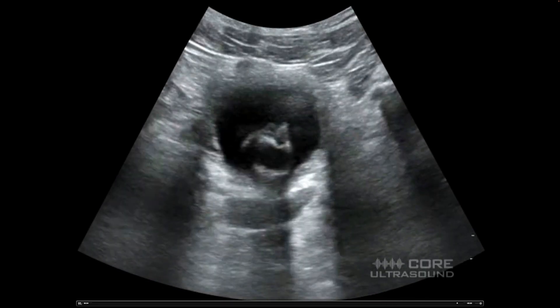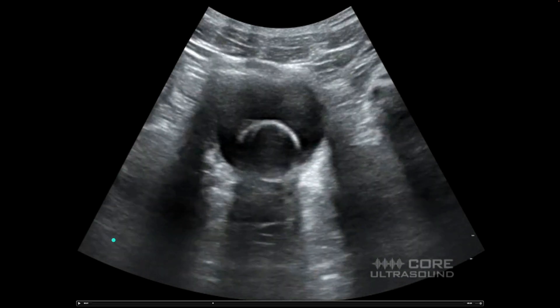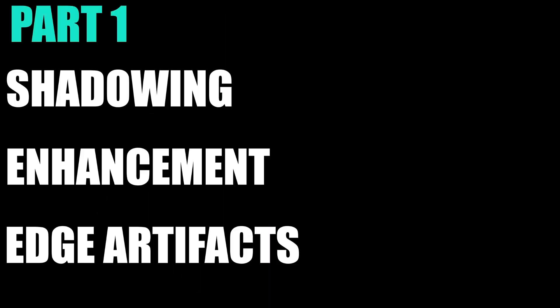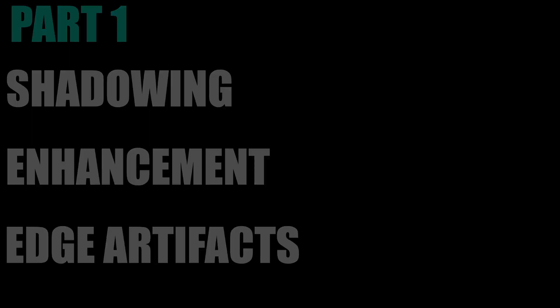In this clip we actually see all three artifacts. This is a bladder in the transverse orientation with a Foley bulb in it. We're seeing posterior acoustic enhancement — it's super bright over here because the urine in the bladder causes minimal attenuation of sound, making it appear bright. The Foley bulb is attenuating the sound a little bit, which is why it's darker there. On the edge of the bladder you see some blackness — that is an edge artifact, seen to a more dramatic degree on this side. So we have edge artifact, posterior acoustic enhancement, and a bit of shadowing from the Foley bulb — all three artifacts in one.